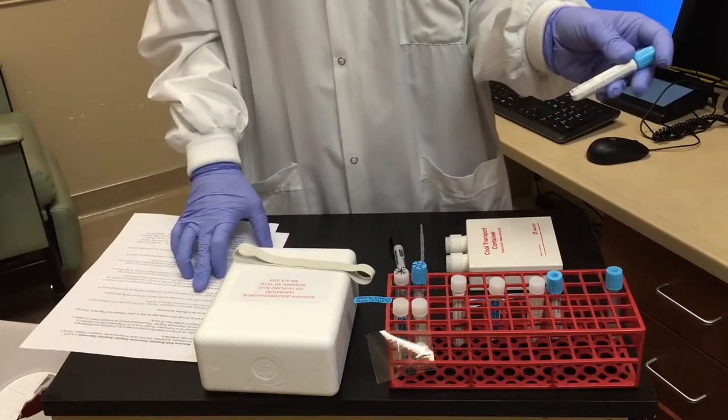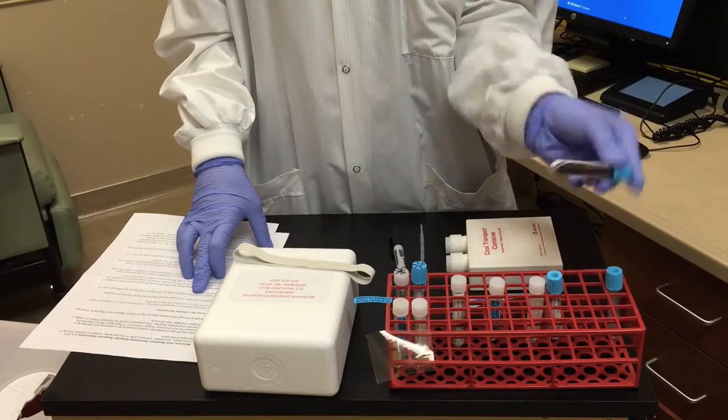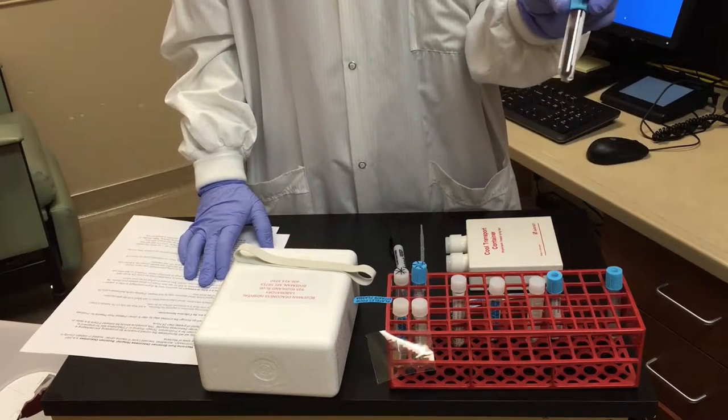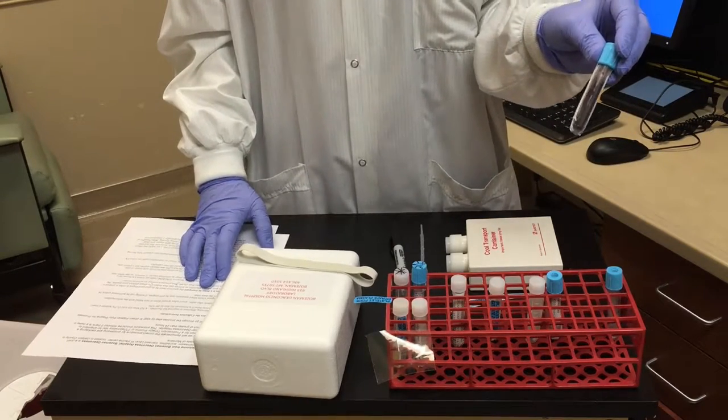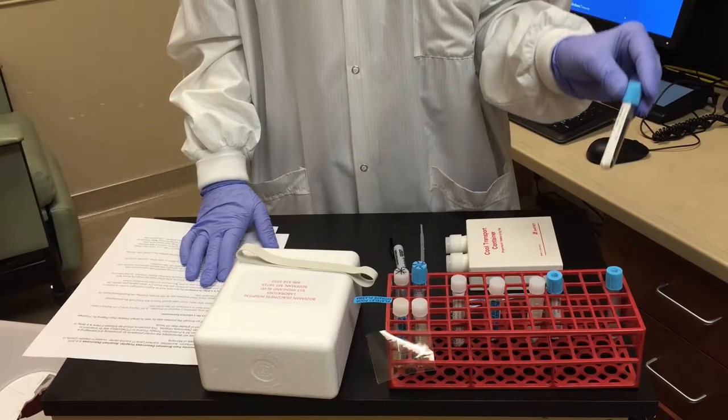Immediately after the draw, you're going to invert the tube several times to mix the blood with the anticoagulant. The original whole blood specimen may be sent unspun if the testing can be performed within 24 hours of the draw time.